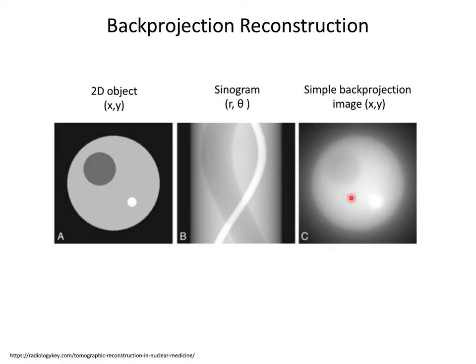It turns out that simple back projection is a form of integration, right? And so to do the inverse problem, basically we've integrated this signal through here, and when you back project and push that signal all the way back, you have to modify the actual signal by the Jacobian of doing integration in polar coordinates, because our data is in polar coordinates now, and we're projecting it back into XY coordinates.